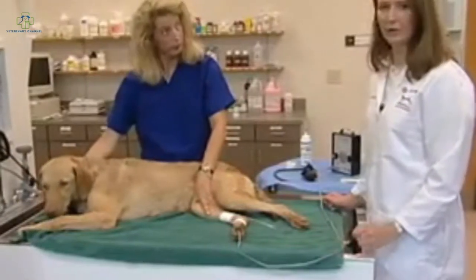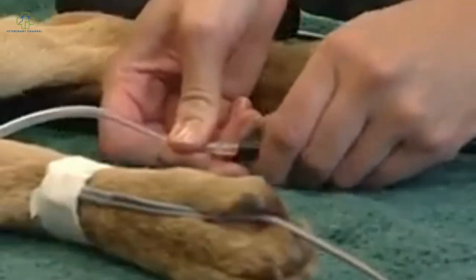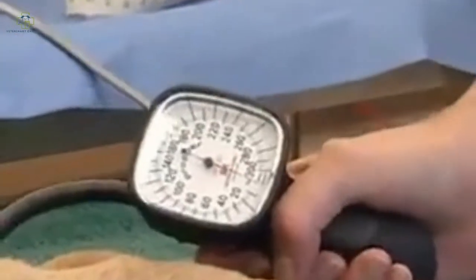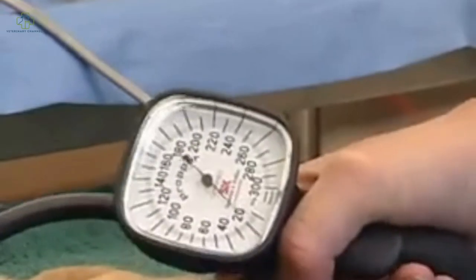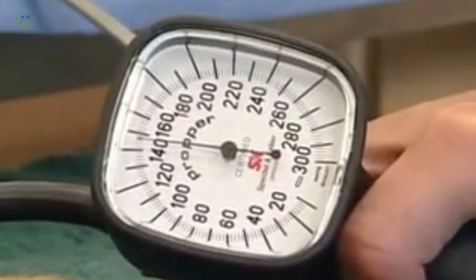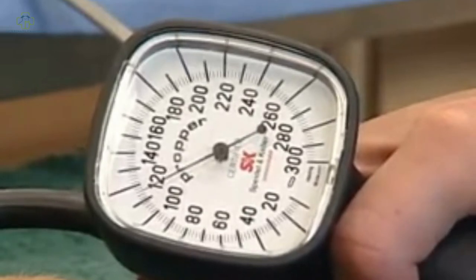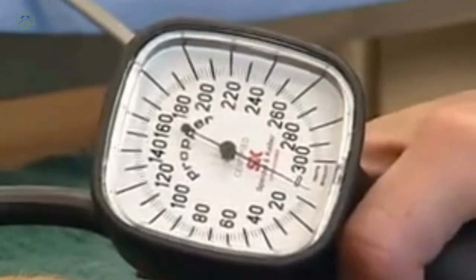Once you have a good reading on the Doppler and can hear the sound well, you can go ahead and connect the sphygmomanometer. I'm now going to inflate the cuff until the sound disappears — about 20 to 30 points past the sound disappearing. I'm then going to slowly release the cuff until the sound reappears, accomplished by slowly releasing the red button. The point at which the sound returns is the systolic blood pressure, which in this case was at around 115 millimeters of mercury.